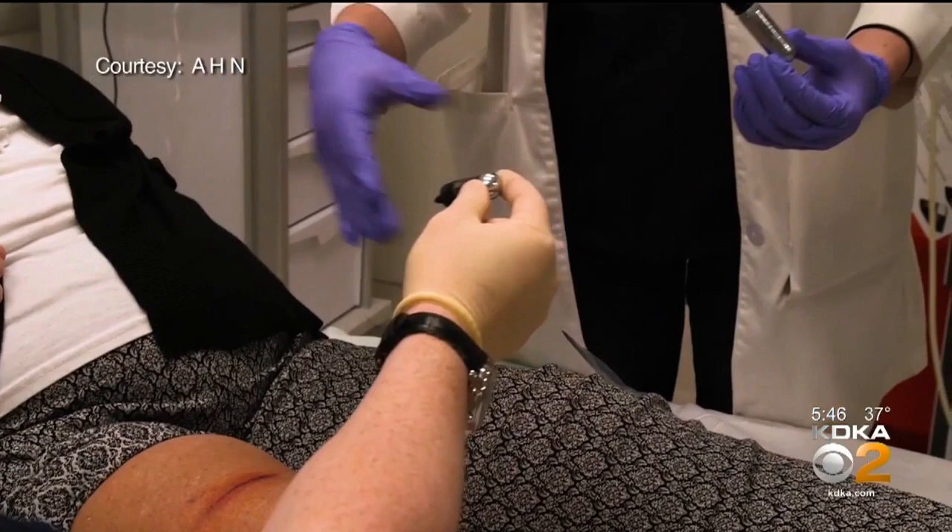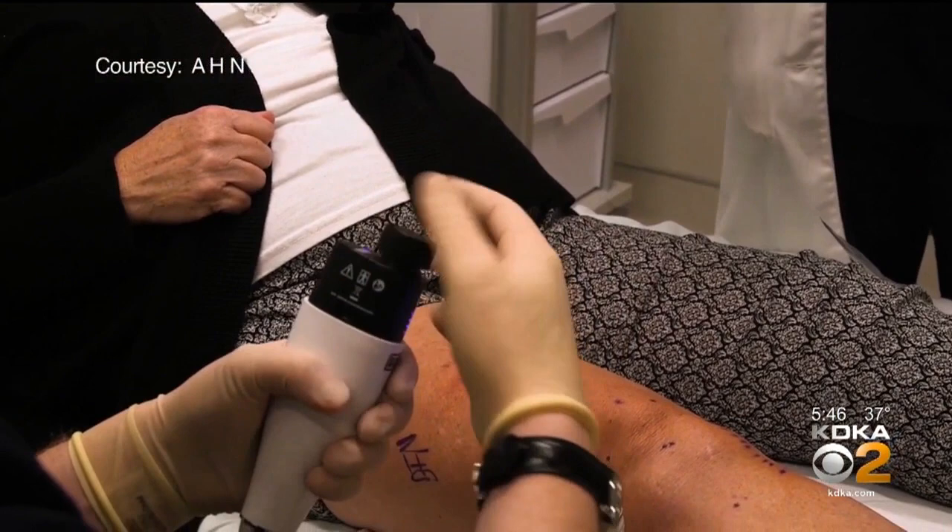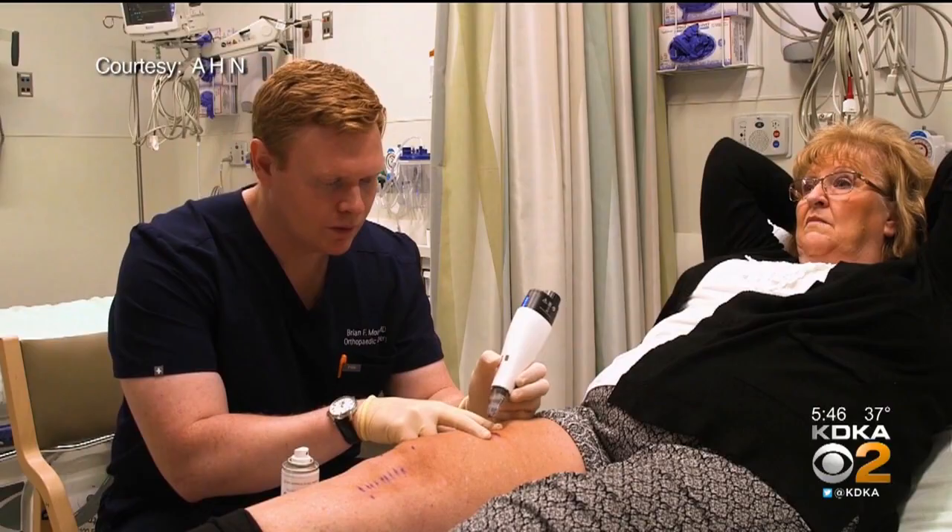When Cindy saw the three prongs coming in, she thought it was going to hurt. But all she really felt was pressure — no pain at all.